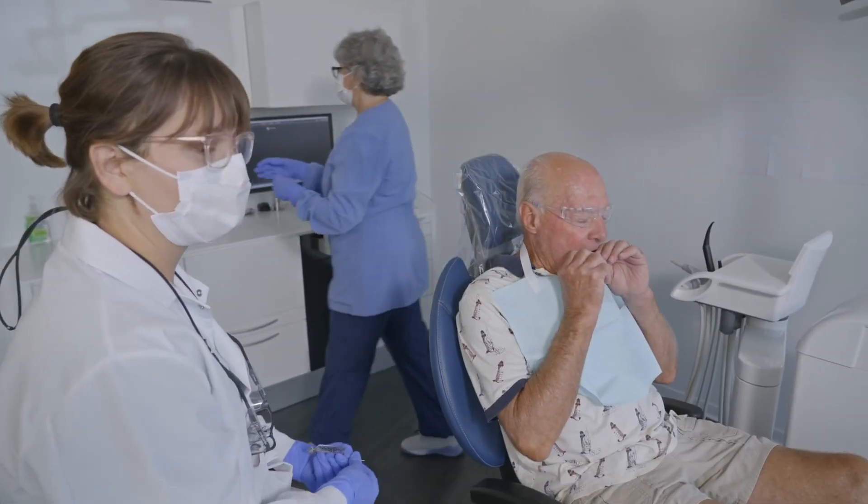Dentures are difficult in the first place. They're difficult to manufacture and we're looking for a high degree of satisfaction from our patients who have dentures.